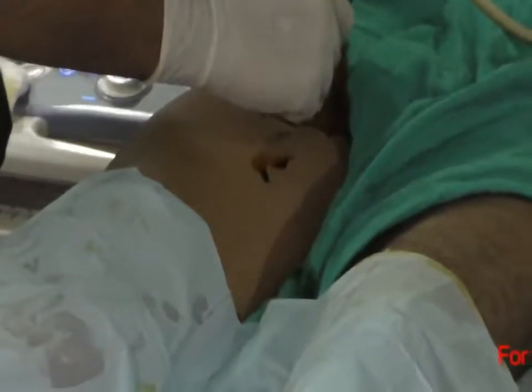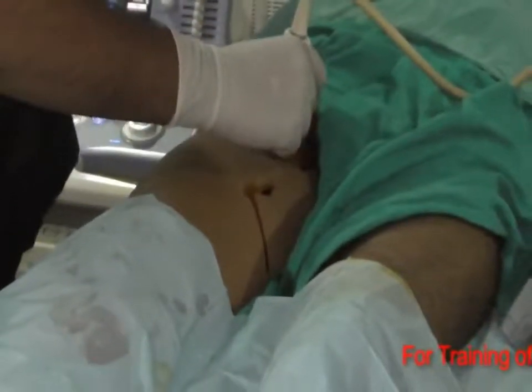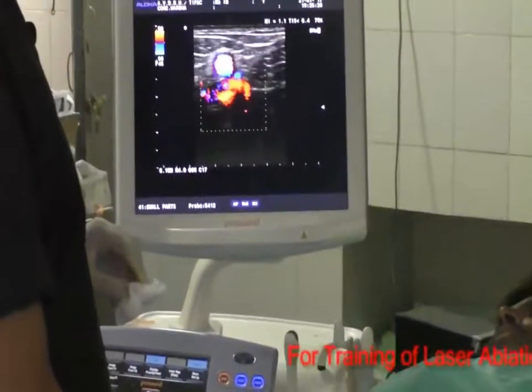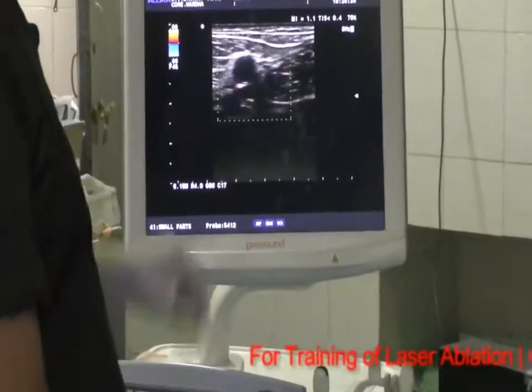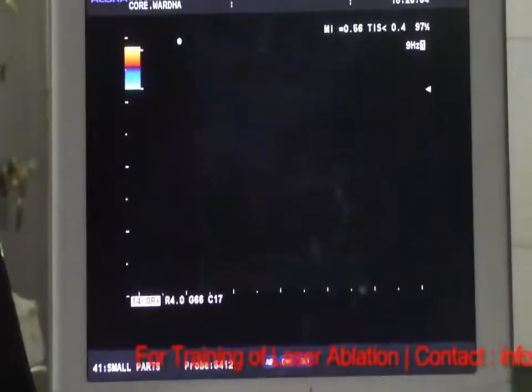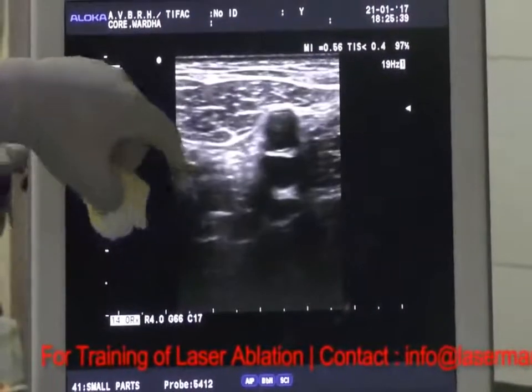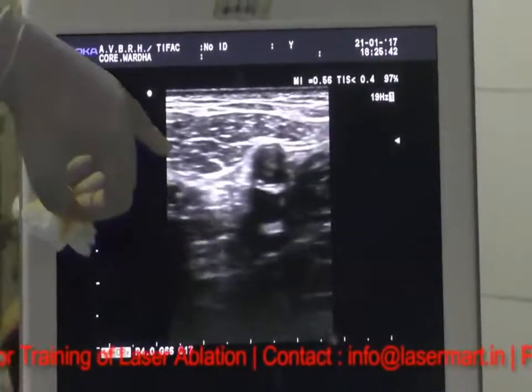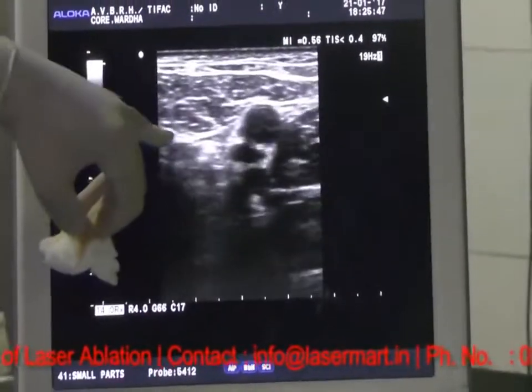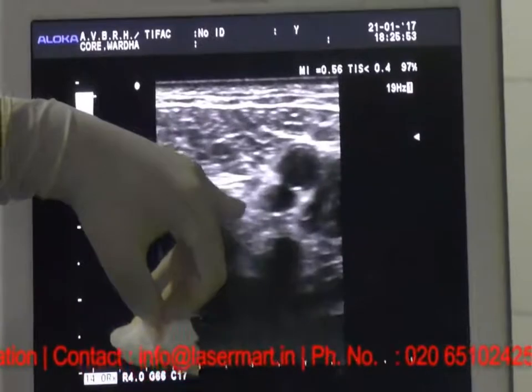What you can appreciate here is this one is the artery and you have to come with the flow. Now this is the common femoral artery and lower to it is the femoral vein. If you can appreciate one thing, the silver lining coming up is fascia lata, and the lining going down just covering the femoral sheath is also fascia lata.